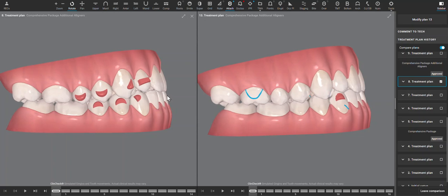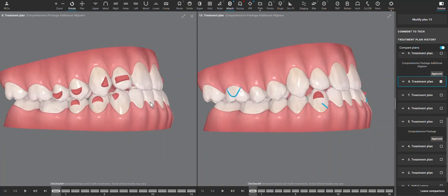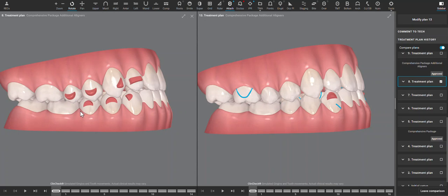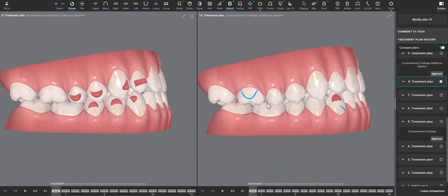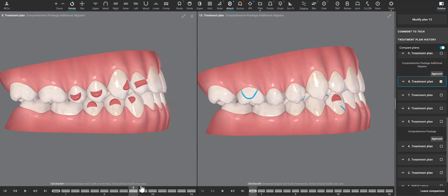In fact, what I find a lot of times happens with these trapped Class 3 patients is even with lower IPR and creating overjet, the mandible then still wants to come even more forward given the opportunity, and they start to look even more Class 3, which is what's starting to look like what's happening here.